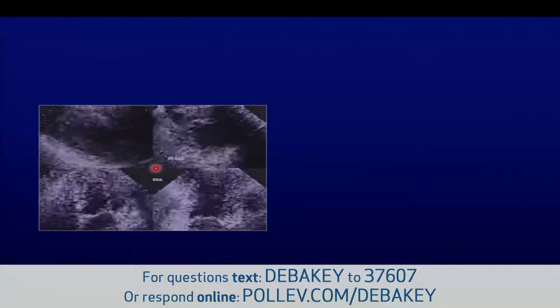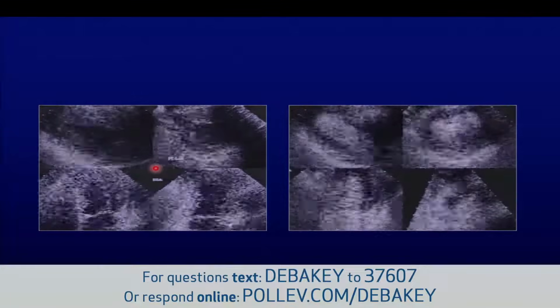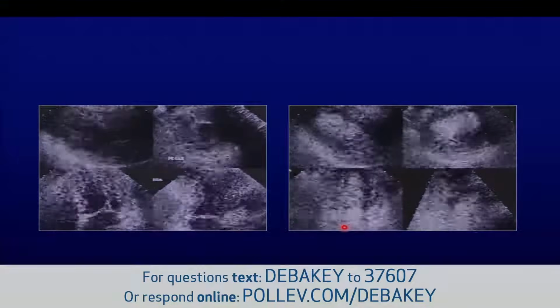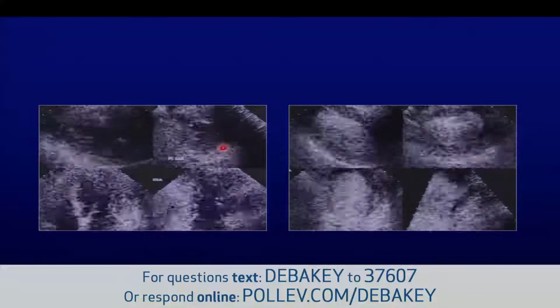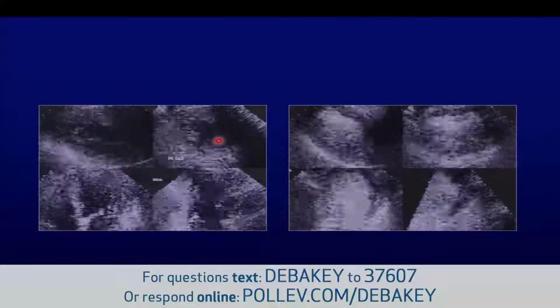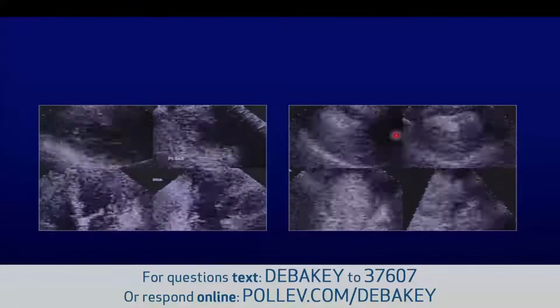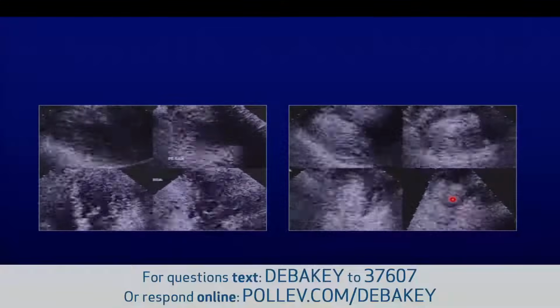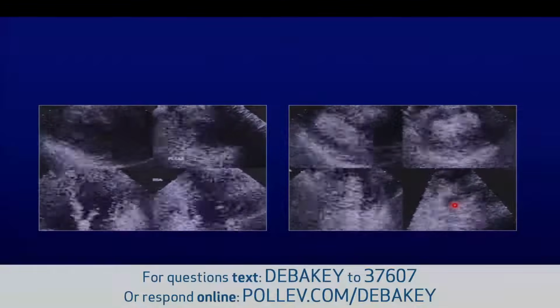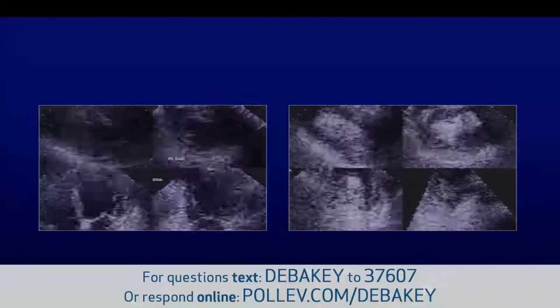And that was at the early days of contrast use, so we used contrast, and a very unusual kind of situation, because what happened is, I personally read this case as I extrapolated this area, but this area turned out to have a large aneurysm. Very unusual location. You could see it here in the anterolateral area, very focused, as opposed to your apical area.